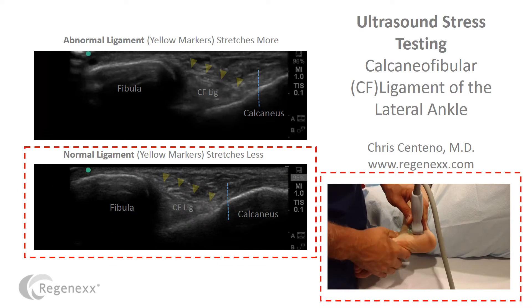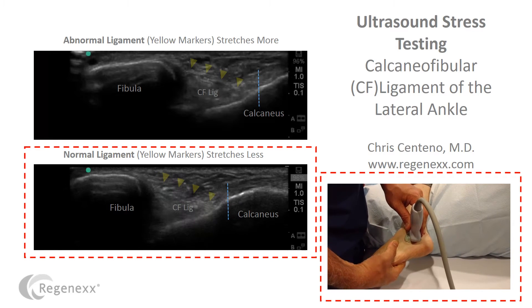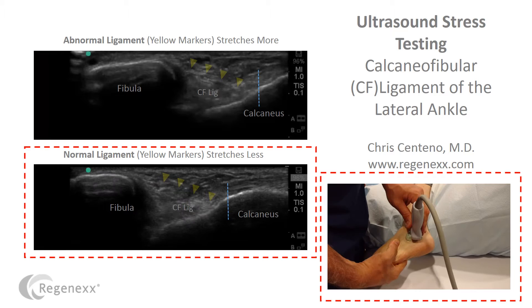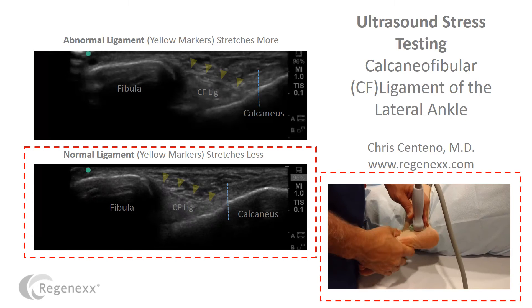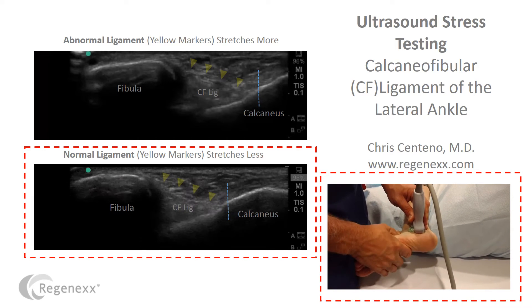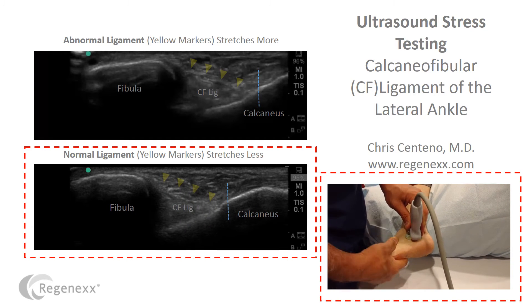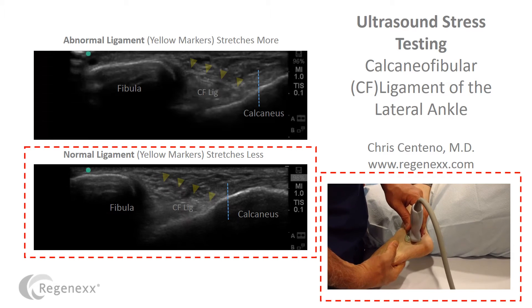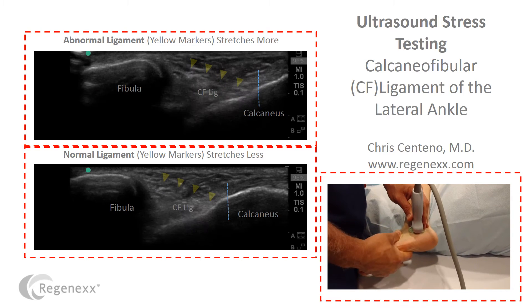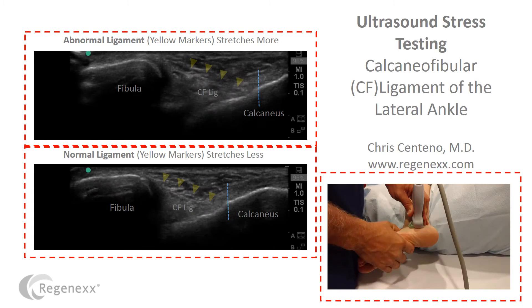If we look at the bottom left there and we see a normal ligament — you can see the normal ligament and I'm stretching that. This is the ultrasound image I just took. You can see the fibula on the left, the calcaneus or heel bone on the right, the markers delineate where the ligament is going, and you can see the CF ligament there. Now this one stretches a little bit, but not as much as the one up top stretches.